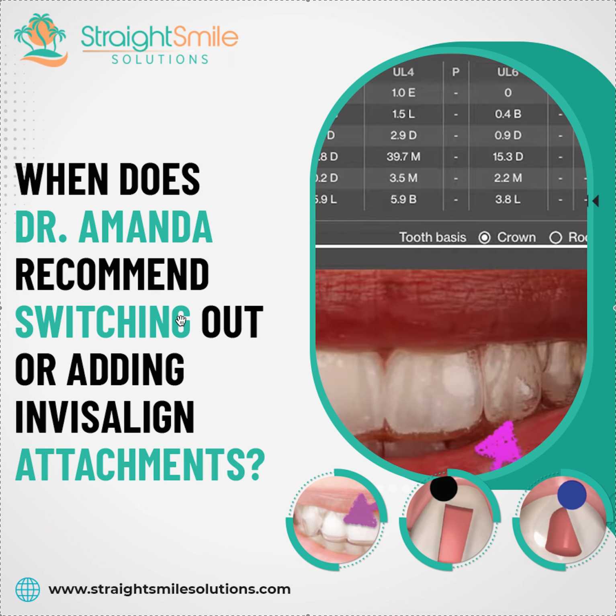So you can't assume that you're going to get from A to Z in one round. And even if you did, it's probably going to be like 100 aligners. You're going to need multiple refinements on those cases. So in those cases, maybe not as predictable with the attachments. But I don't necessarily think switching them around is going to help you. I generally go with what they say. There's a few things that I do just to double check. And I don't even switch out any attachments, or you guys are putting crazy stuff in your preferences.